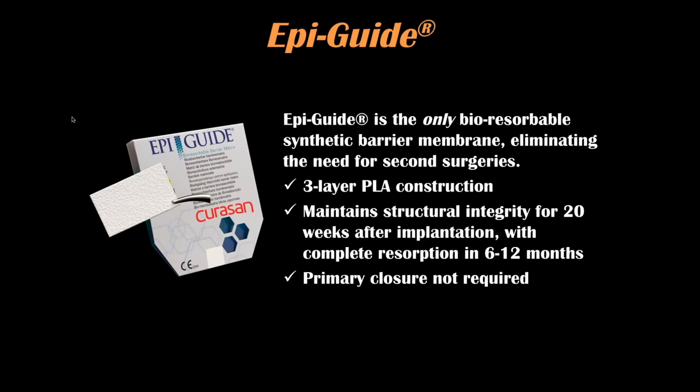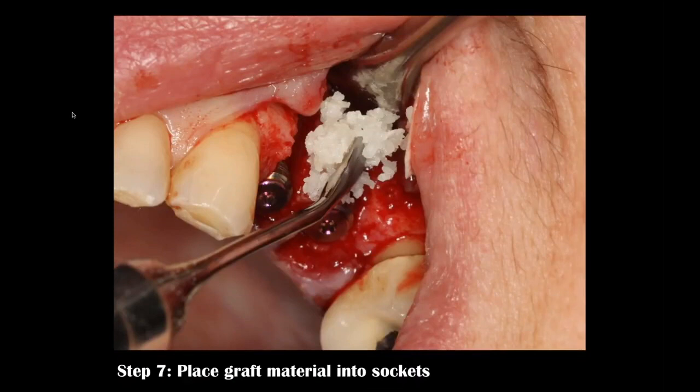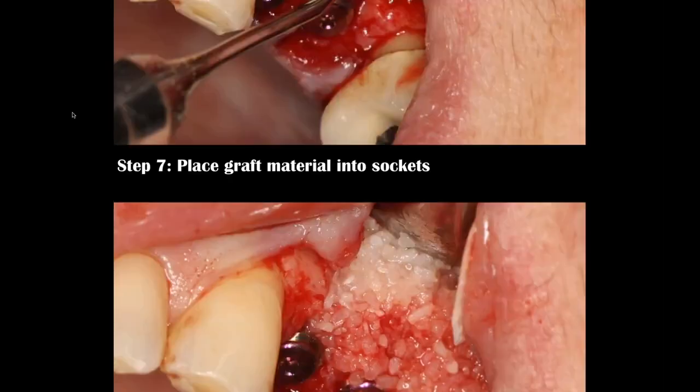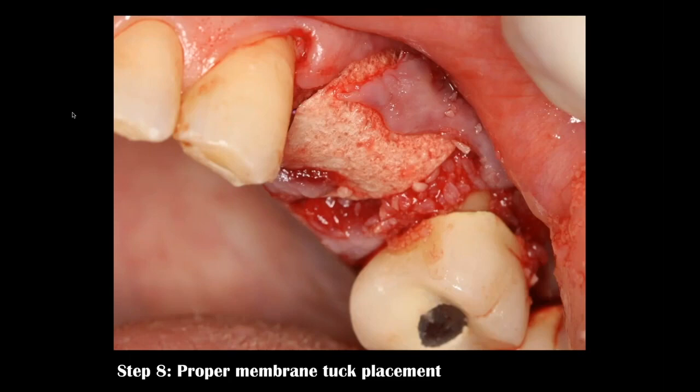We don't need primary closure, which is important. If I have an eight-millimeter defect, my membrane must be placed at least two millimeters beyond the defect. You can see it's placed very passively — as dentists we tend to want to tuck and push and tug, but if we can see the defect we can repair it. I'm packing the wetted allograft material around the defect precisely and placing the membrane at least two millimeters beyond the defect facially and onto the palatal surface.